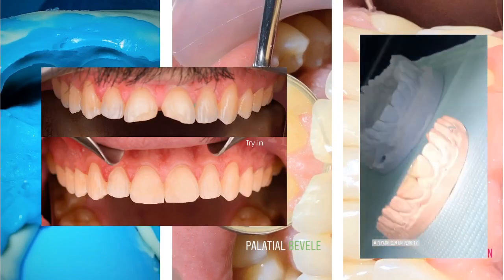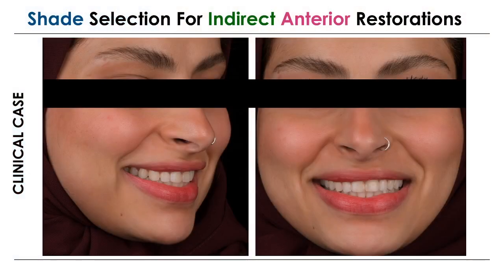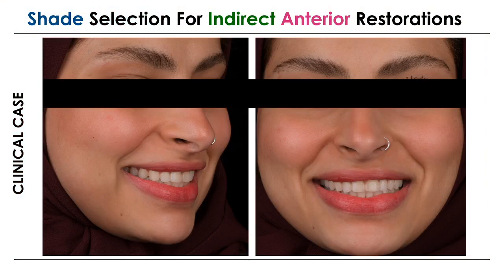We can see little differences in try-in, and I tried to put a neutral resin cement just to match it to the tooth color. And now in this case, she wanted her 2 central incisors to be matched.